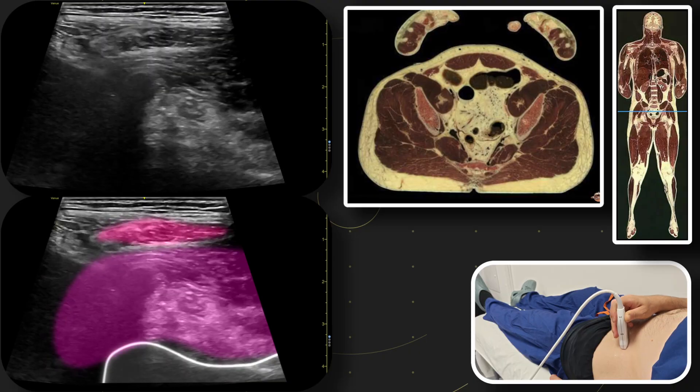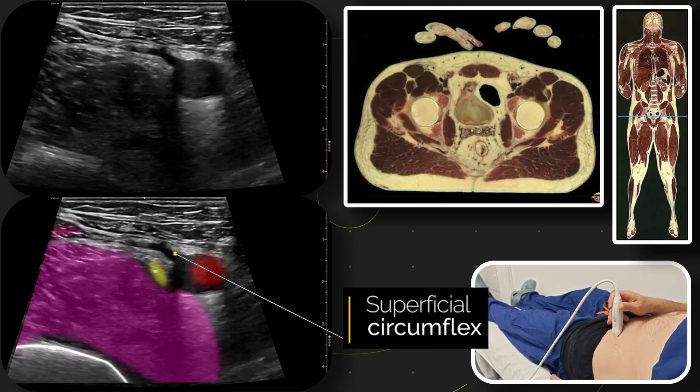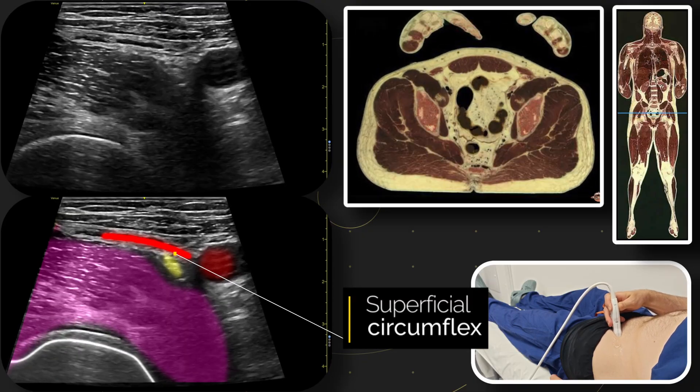Here we can see an important artery to keep in mind. This is the superficial circumflex iliac artery, which can often run quite close to where you might be needling.